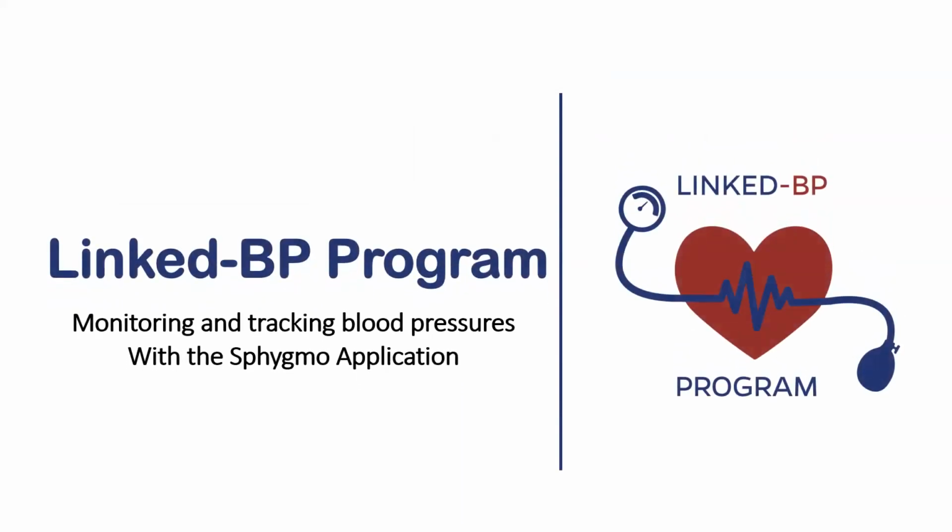If you find you are still having trouble keeping track of your blood pressure, having problems with your machine or the app, or if you have any other questions, please reach out to your community health worker.